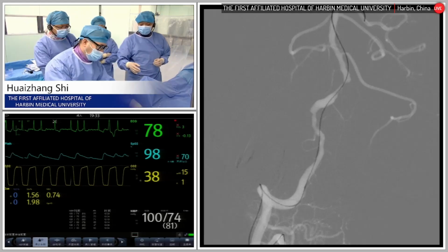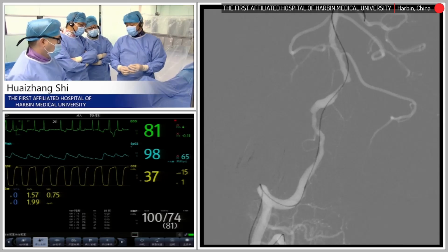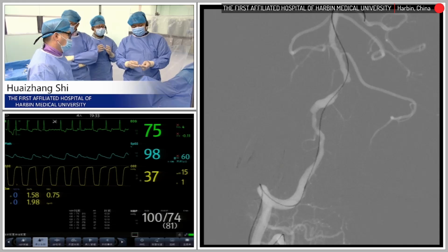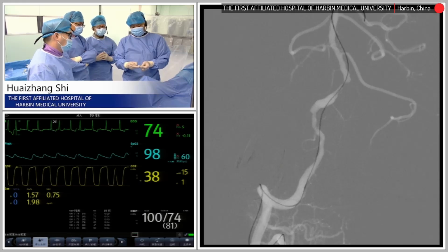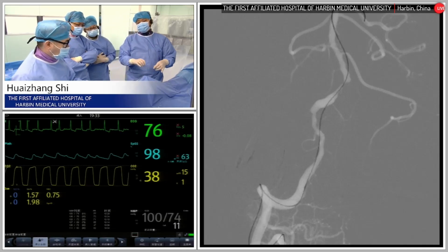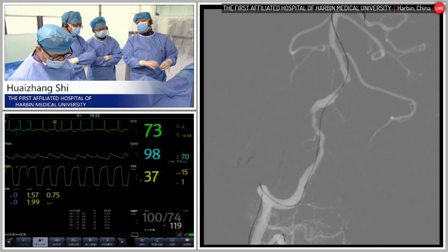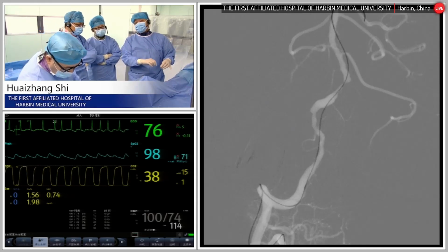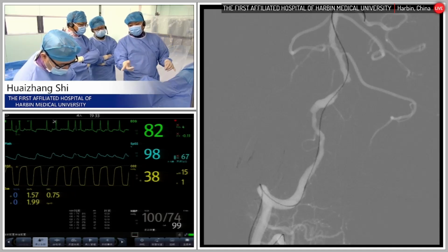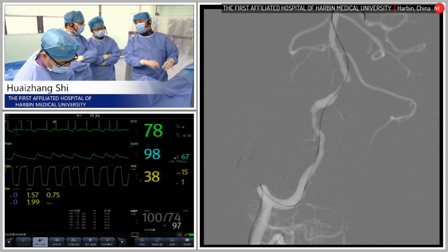Fastunnel. Yes. I don't know if the camera can give us a close shot to let us have a better look at this new device. Before this device, we used the Wingspan stent and the Gateway balloon. The system is Stryker's production, but I think this is much easier than the Gateway and Wingspan system.